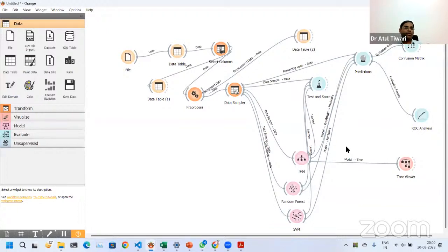I demonstrated the morphometric analysis of breast cancer FNAC features. First, you need to understand that this data set was not created in just a day. If you have seen how morphometric analysis is done, you might easily understand how this data set is created. We put the slide under the microscope and it connects with the software, where we can label each and every nucleus and create particular parameters, for example area, texture, diameter, all those kinds of features. Even my thesis topic was on morphometric analysis of thyroid diseases using FNAC features.